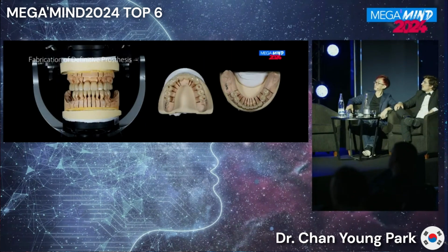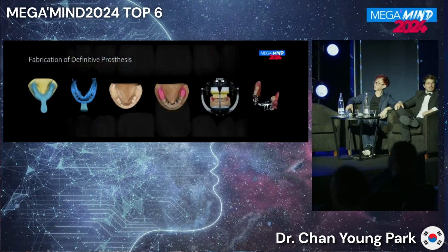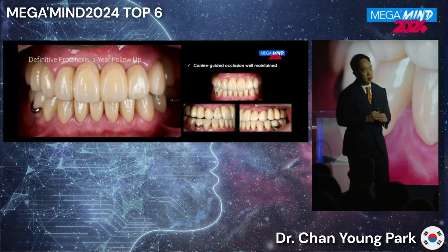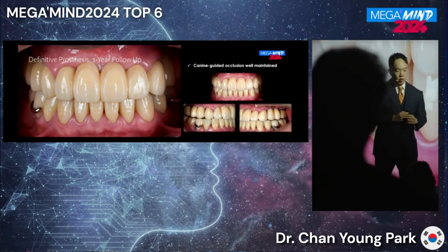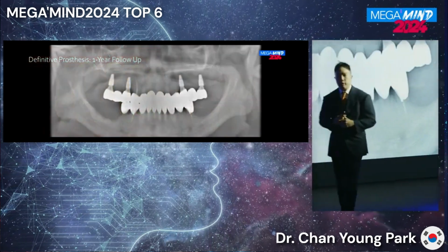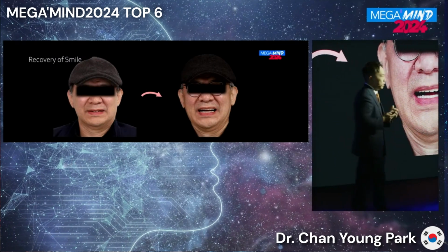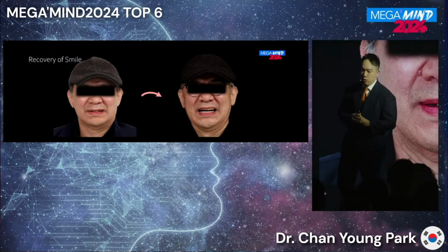So these are the finally fabricated zirconia crowns along with the final dentures, delivered to the patient. And this photo was actually taken 1 year after the delivery for the follow-up. And all the soft tissues, the prosthesis, the occlusal scheme, and the bones surrounding the implants all stayed without any problems. So it was a brief case example, but a good example utilizing the digital diagnosis.